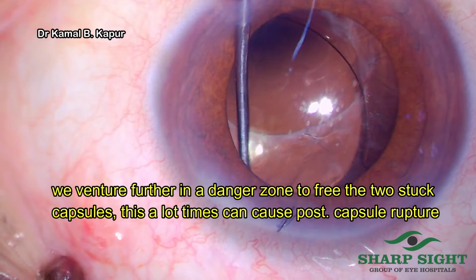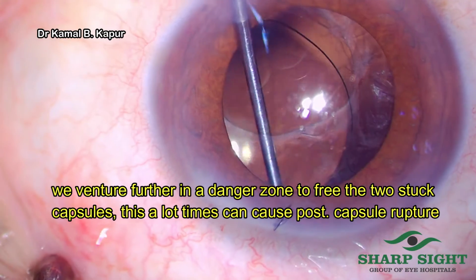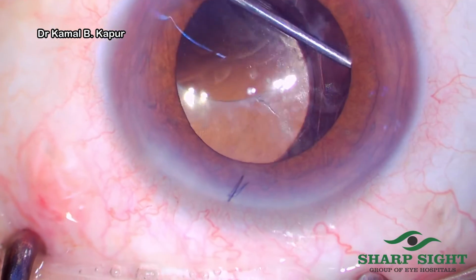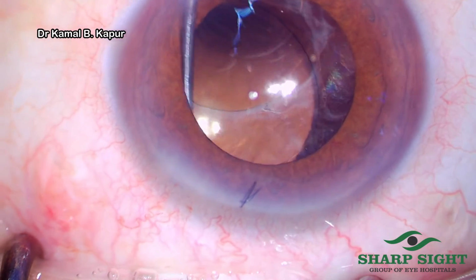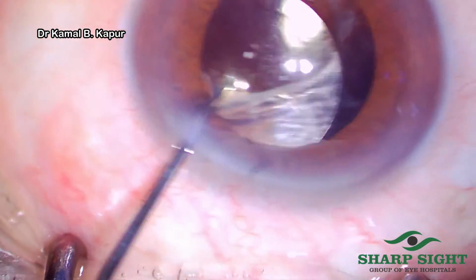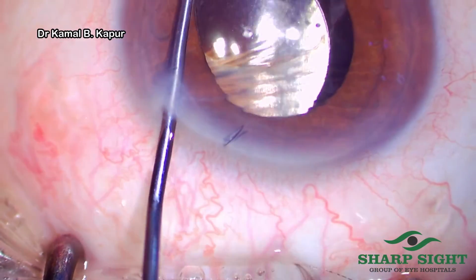We again reattempt to actually break that zone. As we see, there is some resistance there, but yes, we did overcome that resistance. We ended up with some partial adhesions. Now we will again attempt to see whether the IOL tends to go back to its position or not. We see some movement of the lens into that zone which we had just freed.